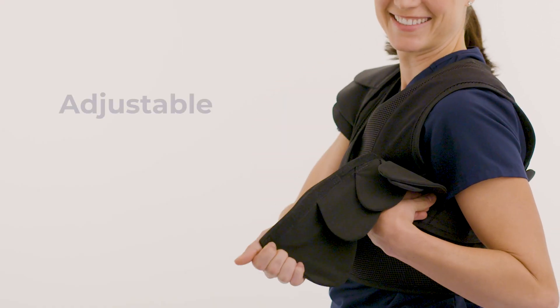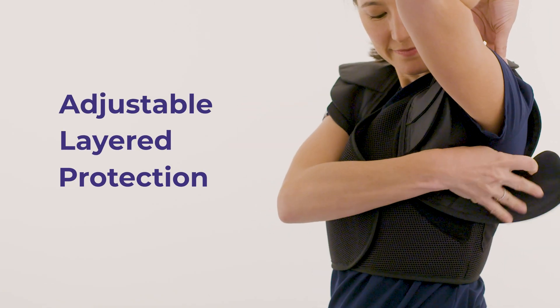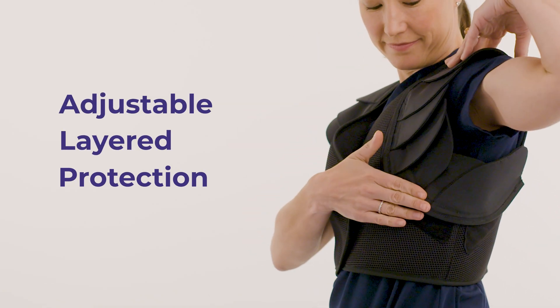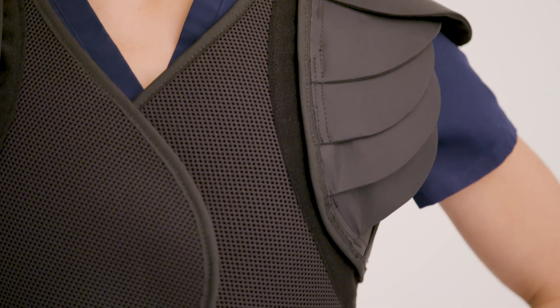What I like about the Under Shield is that it's adjustable. You can really adjust the layered protection to fit exactly where you want it to be. Unlike wings that go over the shoulder or sleeves that go down the arm, this is a comfortable option that provides maximum protection underneath the arm where we need it most.